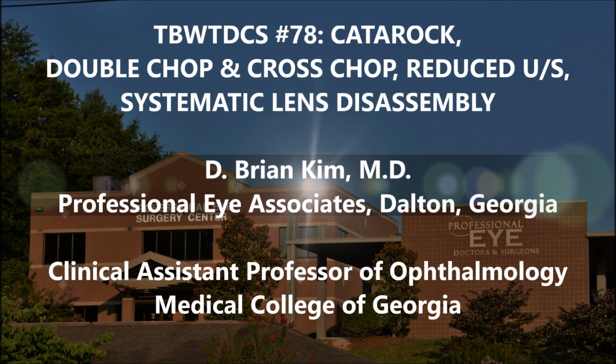I'm going to share with you case number 78 in the best way to do cataract surgery series. This is a very dense lens which we call a Catarock, and you're going to see double chop, cross chop, mechanical fracturing techniques, and systematic lens disassembly utilizing reduced ultrasonic energy using mechanical fracturing forces to carefully disassemble the lens in a very careful and methodical manner.